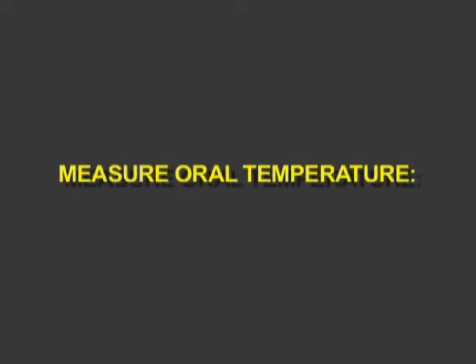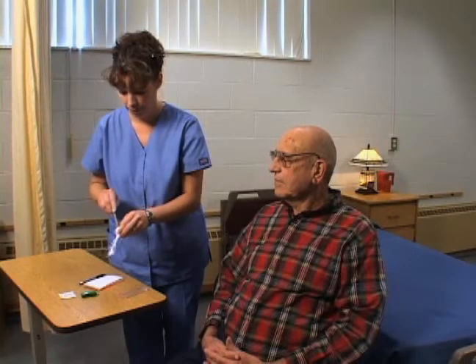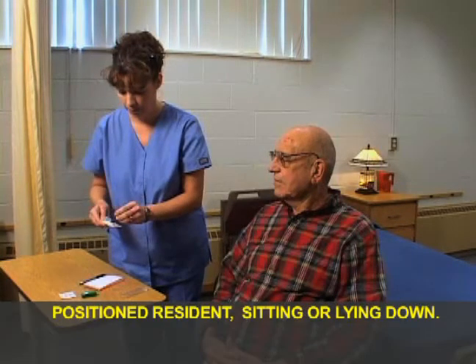Measured oral temperature. Positioned resident sitting or lying down.